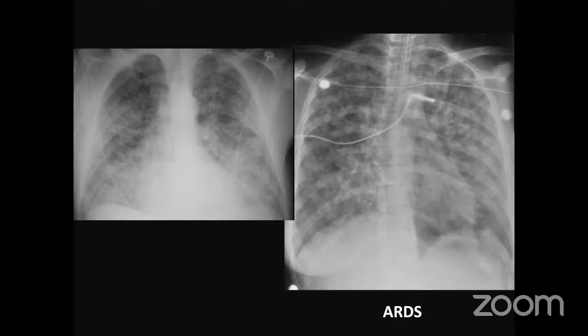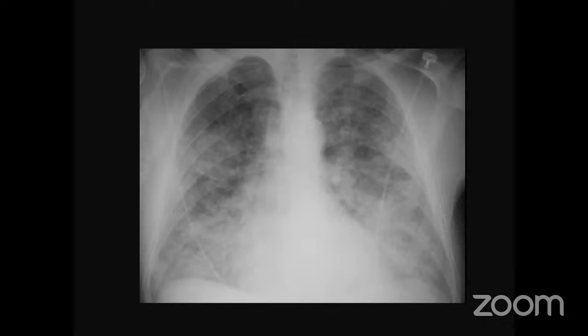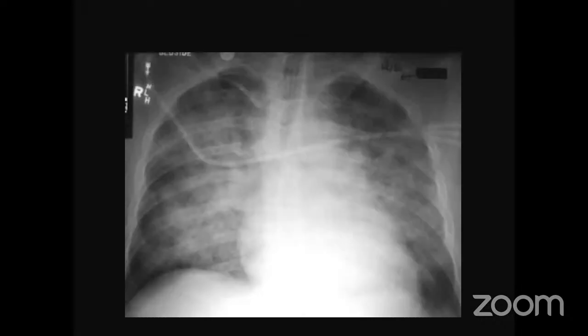Yeah, thank you. Afsar, can I ask you a question? As a clinician who looks after about 30 patients or beds in a day, there is this question often asked: we repeat the X-rays, and we would like to have a resolution of symptoms in ARDS, pulmonary edema or pneumonia, whatever it is. But quite often the radiologists are not very keen on repeating the X-rays, and they say, why are you doing it now? Wait for 6 weeks or 10 weeks. Can you shed some light onto this on a practical level?